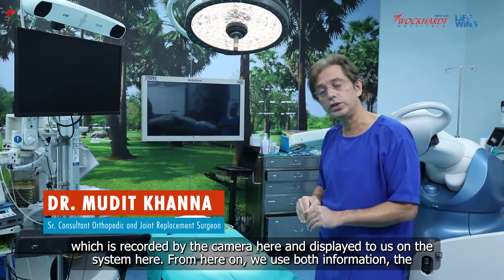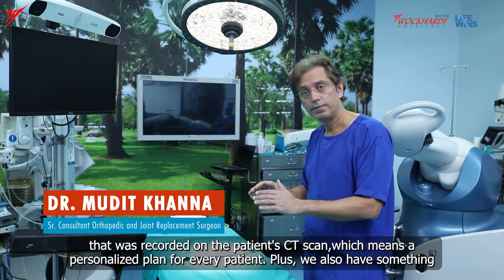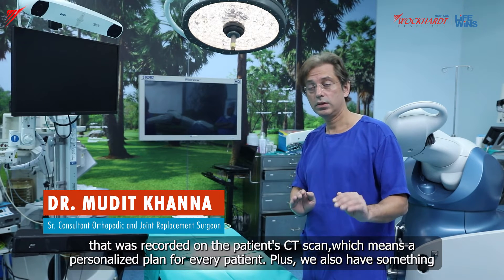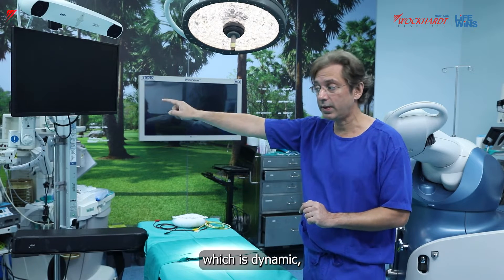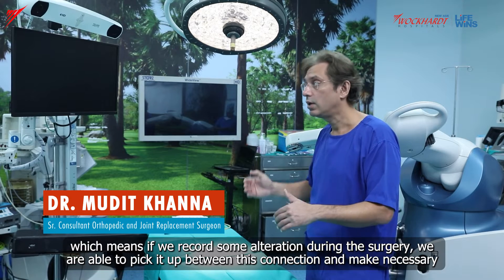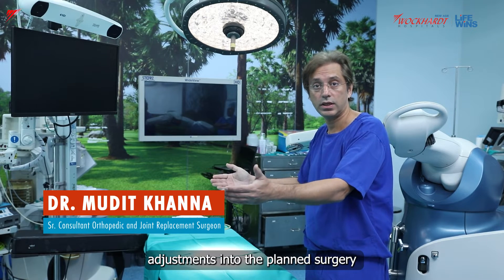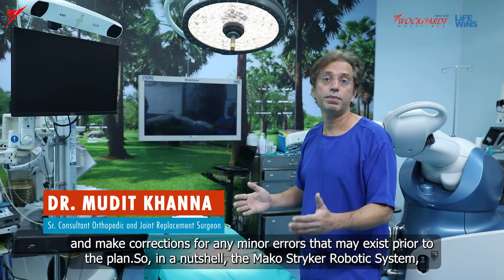We already have information fed into the brain of the entire system — the console — which has a pre-operative plan already made for a particular patient. But we don't rely only on the pre-operative plan; we also capture dynamic information as the surgery progresses, recorded by the camera and displayed to us on the system. From here on, we use both information: the personalised plan from the patient's CT scan, plus dynamic information, allowing us to make necessary adjustments and corrections for any minor errors that may exist prior to the plan.